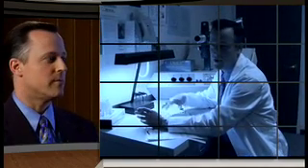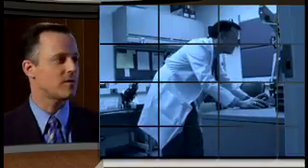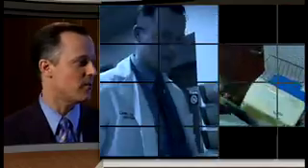So on my typical day, for example, I would be seeing a patient in the clinic and I'd want to show them their macular hole, I want to show them their tumor, or at least compare it to their previous images. Well, of course, I didn't have the images there in the exam lane, so I would go to the OIS workstation, look to see if they had any imaging performed, and of course, there was no imaging on OIS. So then I'd run to the photo box, see if it was in the photo box, no files.